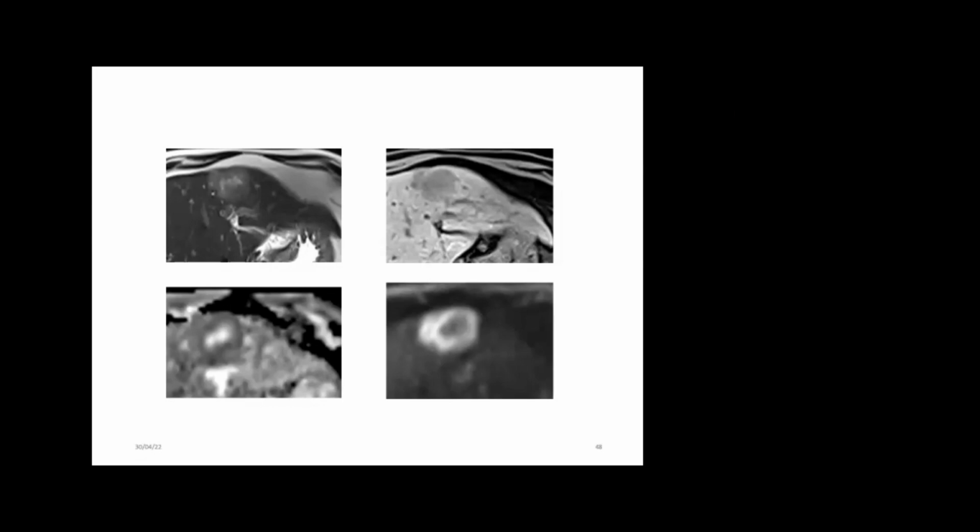I've got another question. Could this type of lesion be a solitary hepatic metastasis? How do you differentiate between a solitary hepatic metastasis in a cirrhotic patient and this?